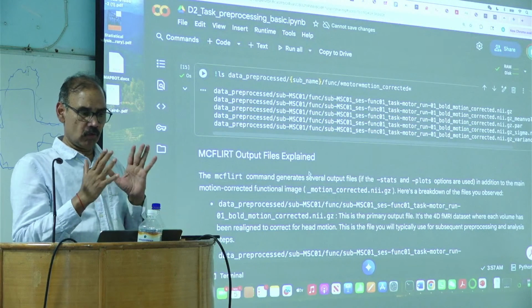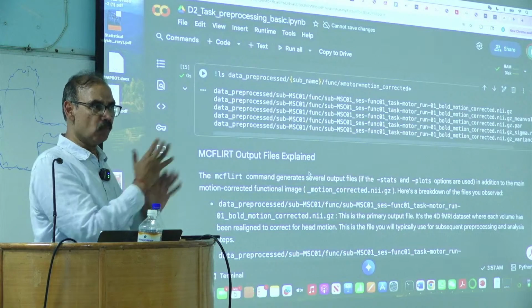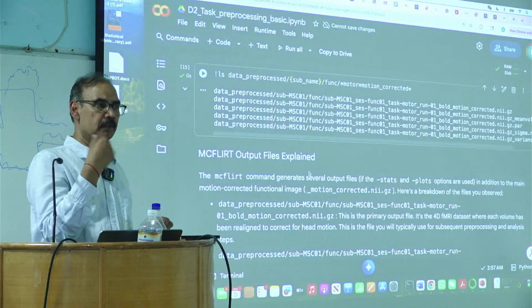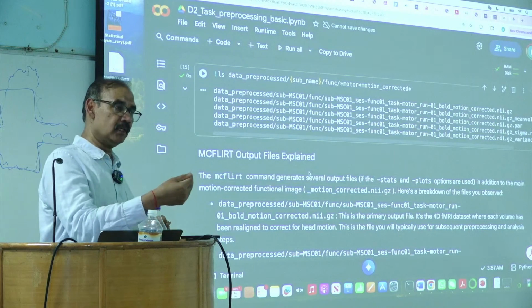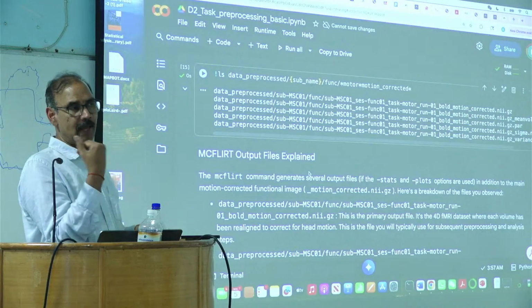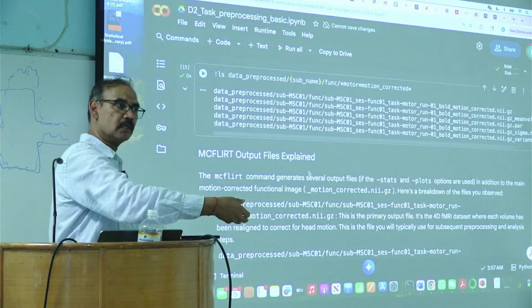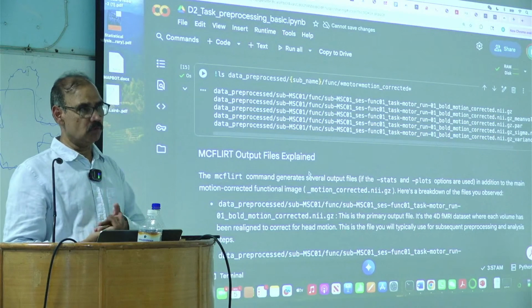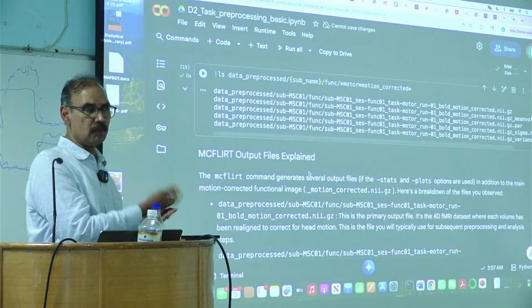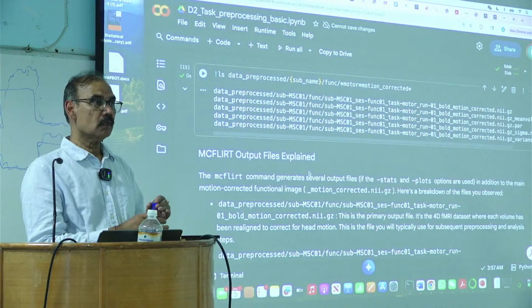And so the only thing where there is a change is the object moving. In DTI, there is a change in intensity, right? So in that case, you're taking a photo as the brightness is changing, right? And then you have to do motion correction. So it's not as straightforward. So it's a little more complicated.